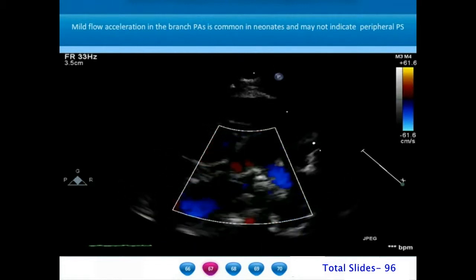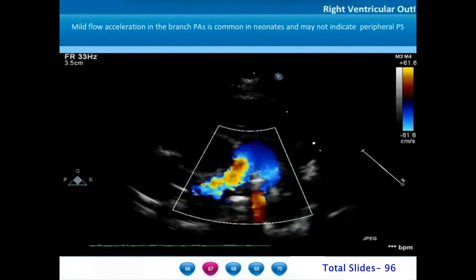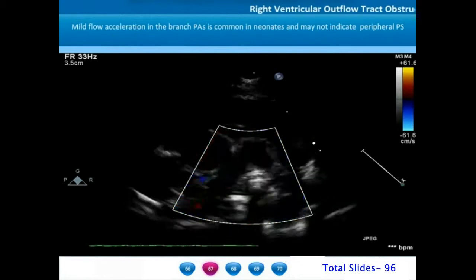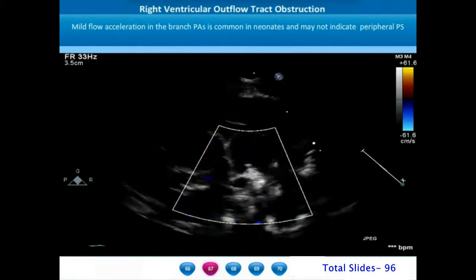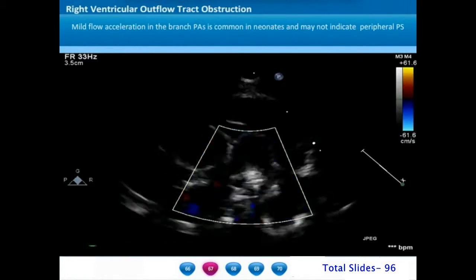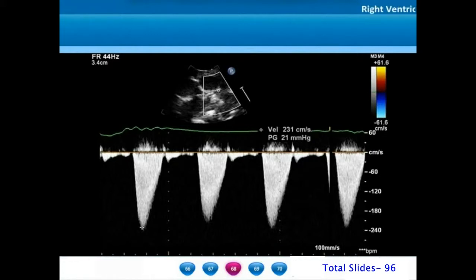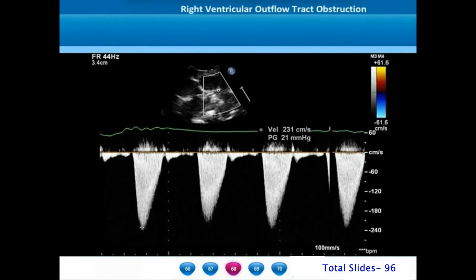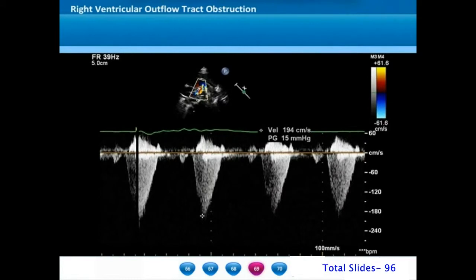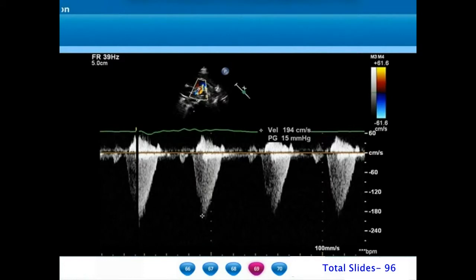In neonates, there can be mild flow acceleration in the branch pulmonary arteries that does not indicate significant peripheral pulmonary artery stenosis. Gradients of up to 20 to 30 mm of mercury can be seen in neonates without functional significance. A pulse wave Doppler on the left pulmonary artery origin shows a peak gradient of 21 mm of mercury, and on the right pulmonary artery a peak gradient of around 15 mm of mercury in this instance.